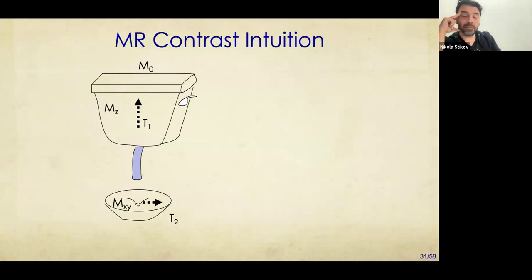And in between, there's many different kinds of contrasts. There's also a combination of T1 and T2. In reality, in the clinic, the doctors will do a T1 and a T2, and basically they will look at them together to make sense of the image. Most of the time, these are the two main acquisitions, a T1 weighted and a T2 weighted, and then sometimes they may add something called diffusion imaging or magnetization transfer or different kinds of scans.